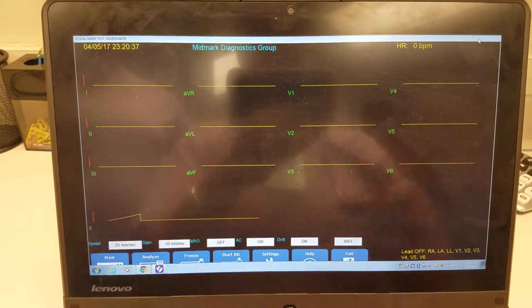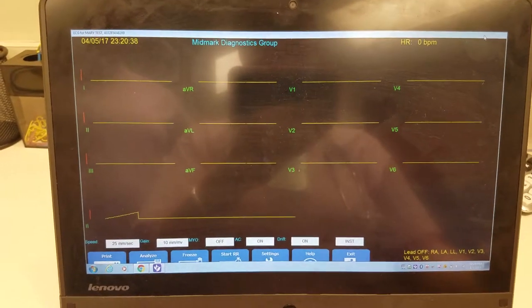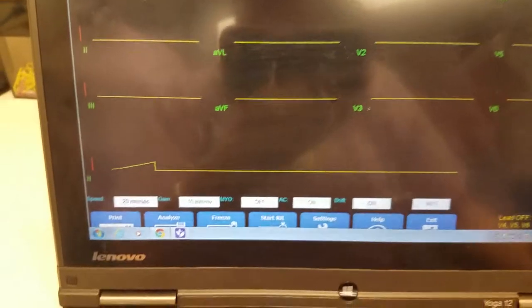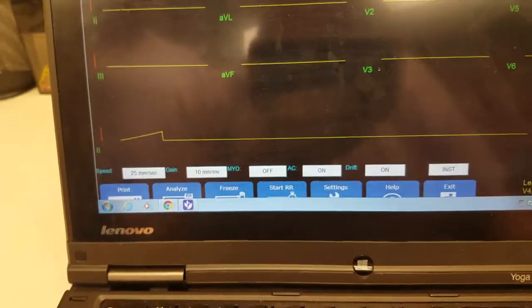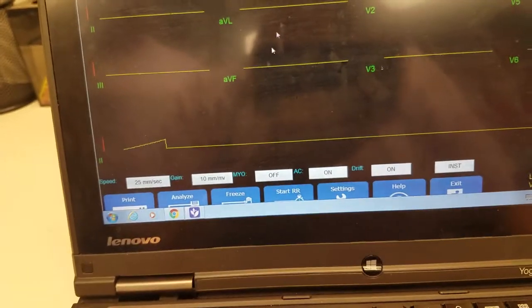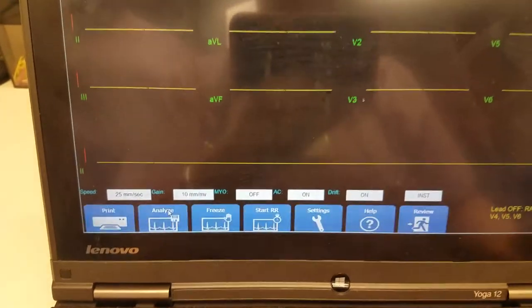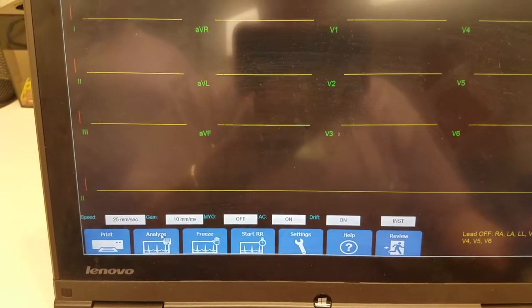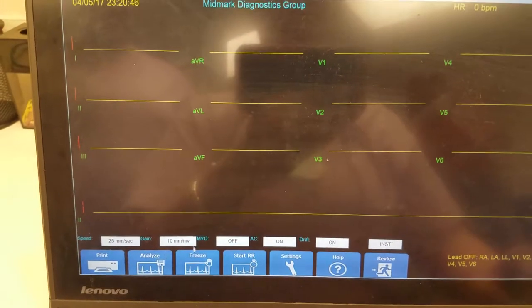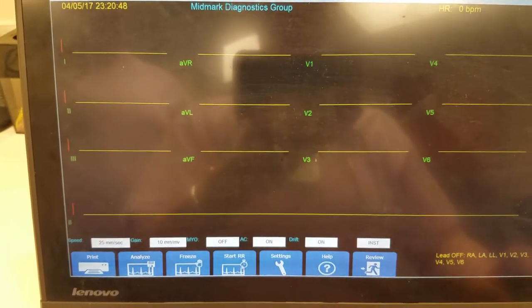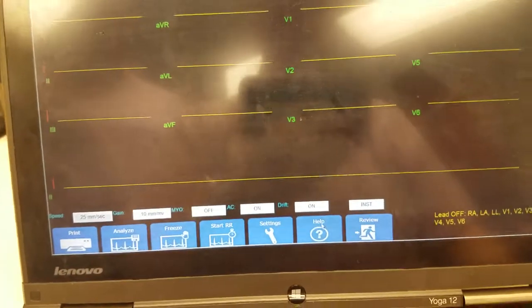You give it a second to calculate the rhythm. Down here, you are going to hit analyze. When it's done analyzing, the buttons are blue again. You hit review.